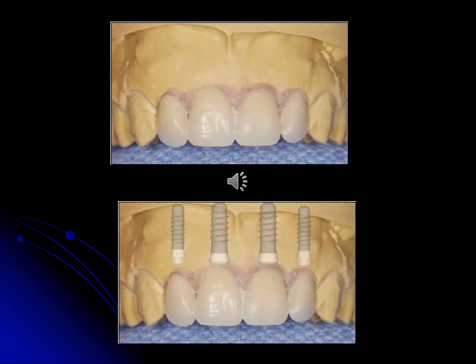Another case, a patient with four missing upper anterior teeth. The first step, we took an impression for the patient and prepared a mounted study cast. We prepare a wax-up to see the final result. Now we have the final result. We will see what the treatment options are. We have multiple options of treatment.